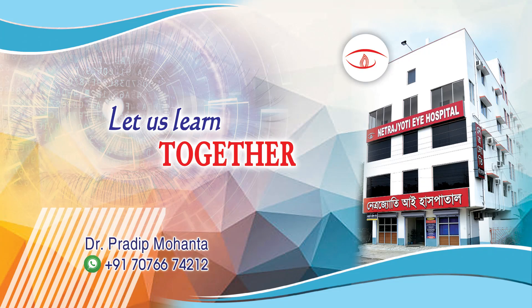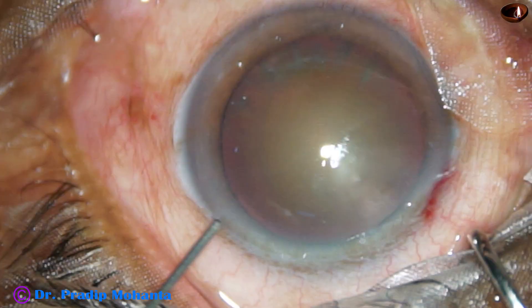Welcome to my workplace at Ranaghat, West Bengal, India. This is a cataract with grade 4 nuclear sclerosis.